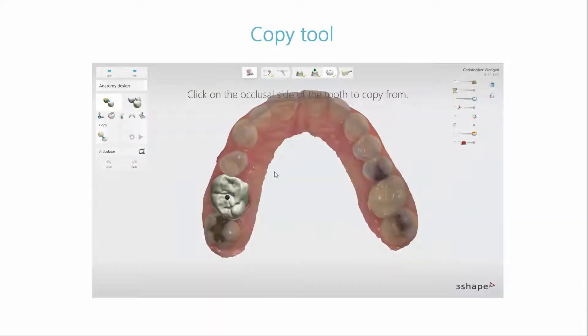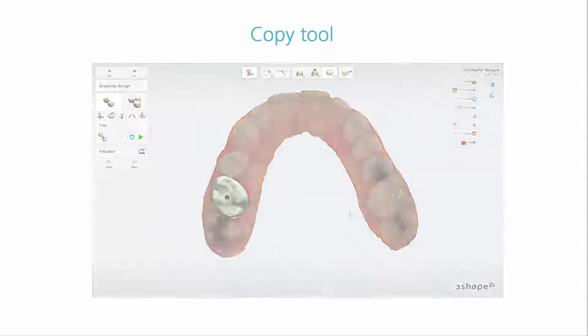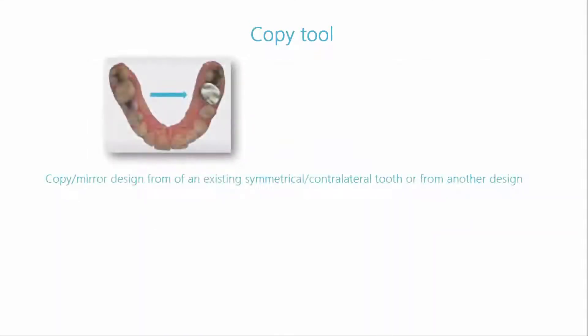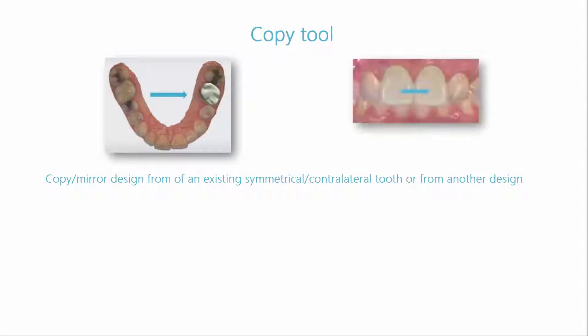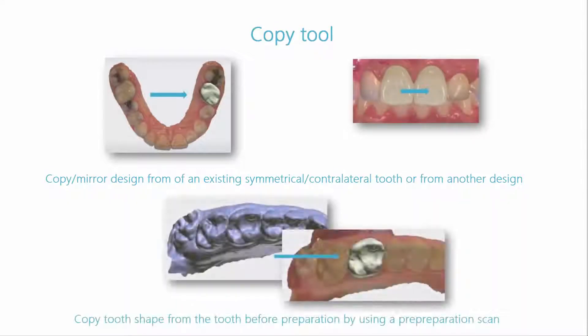The copy tool option can be found in the anatomy design step. This tool allows you to copy the anatomy of an existing symmetrical or contralateral tooth or anatomy of another design. You can also copy a tooth from a pre-preparation scan.